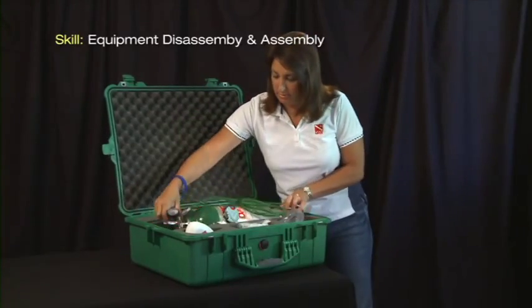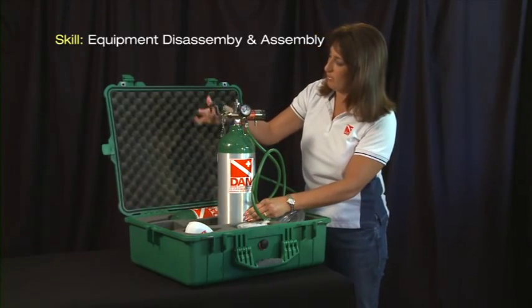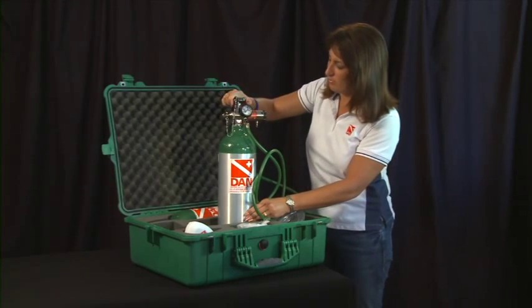DAN recommends the DAN oxygen unit be left assembled and depressurized inside its waterproof case. First, make sure the cylinder is turned off and the unit is depressurized.